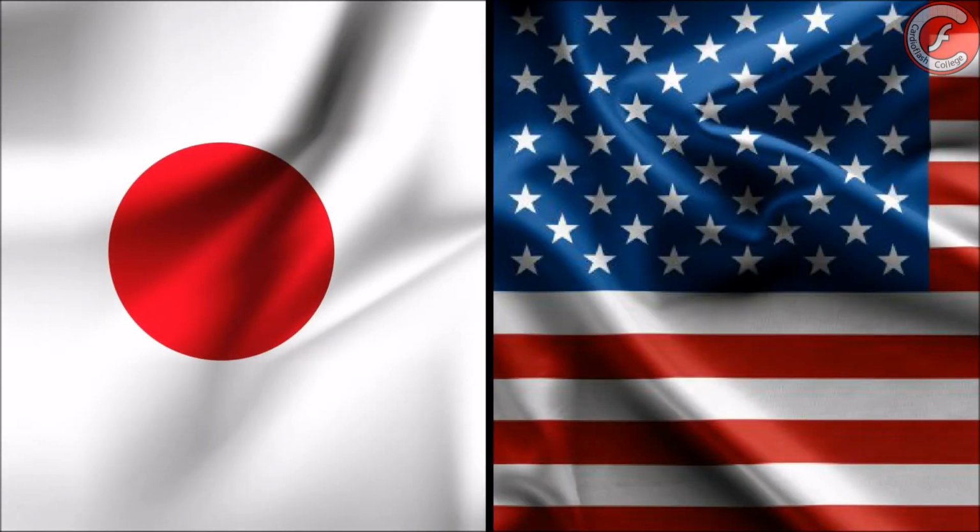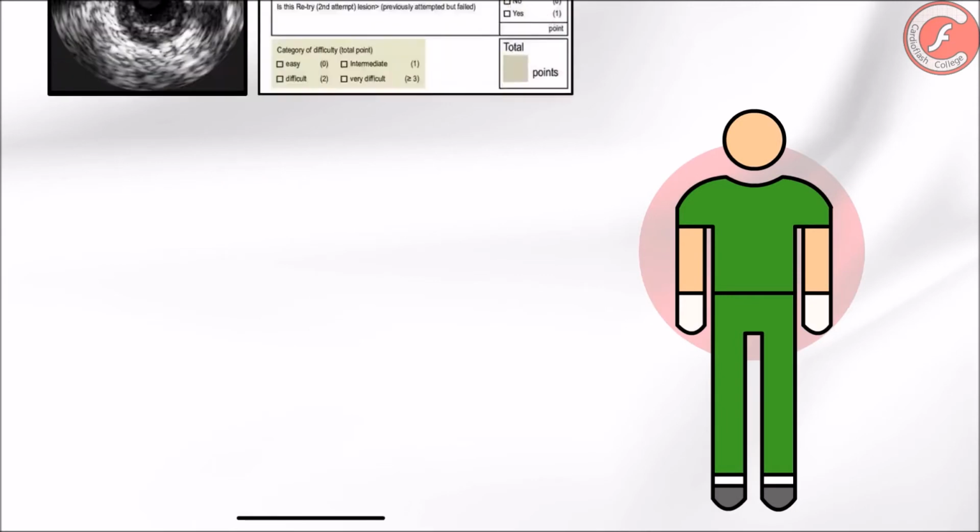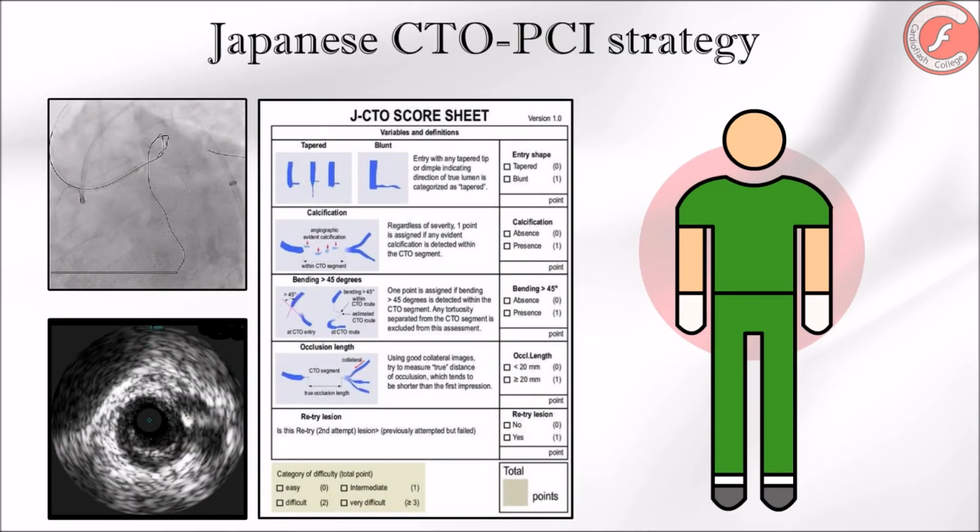Well, let's move on now to the coronary interventionism. There are nowadays two therapeutic paradigms. On one hand, there is the Japanese school, famous for the development of retrograde techniques and the perfectioning of the antegrade ones, building on the selection of patients according to the predictors of success that conform the JCTO score, and optimizing the procedure with the use of intravascular ultrasound, also known as IVUS.